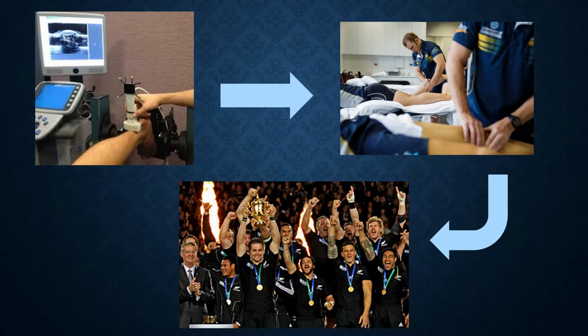So based off the results of this meta-analysis, it may seem tempting to just go ahead and perform a quick ultrasound on various superficial tendons like the Achilles or patellar tendon on every athlete during the preseason, right? Because if you can supposedly predict whether an athlete is at risk for an injury, you should just go ahead and be proactive about this rather than trying to be reactive to an injury that pops up in the middle of the season, right? Maybe not.